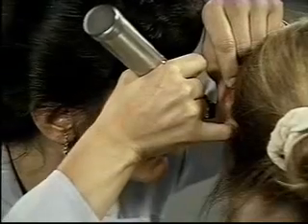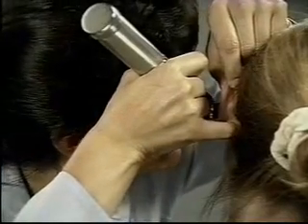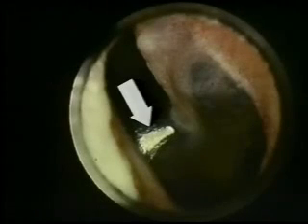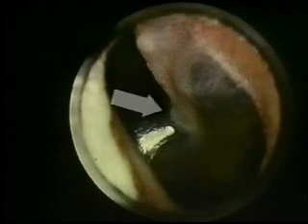There should be none. Slide the speculum slightly down and forward and maneuver it until you can see as much of the eardrum as possible, including the pars flaccida, if possible, and the margins of the pars tensa. Note the color and contour of the eardrum with its distinct cone of light. Normally, the drum is pearly gray.